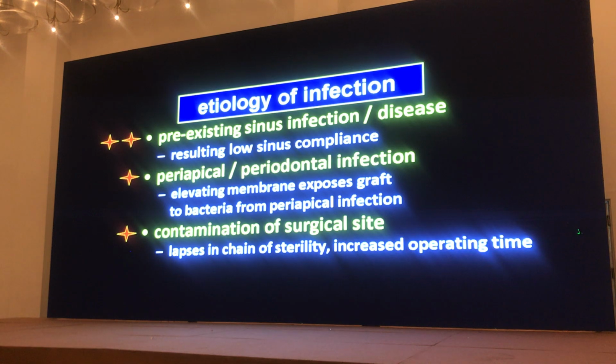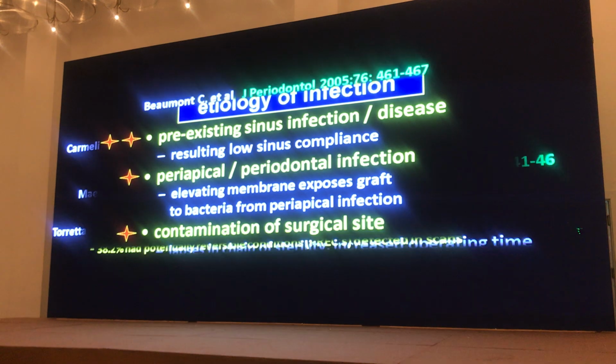And again, we talked about not allowing for salivary contamination when you place your graft material. So if you do all of these things, you are going to pretty much have that 1% of cases that you have a problem with, and no more than that.